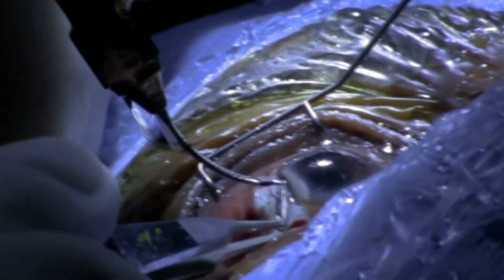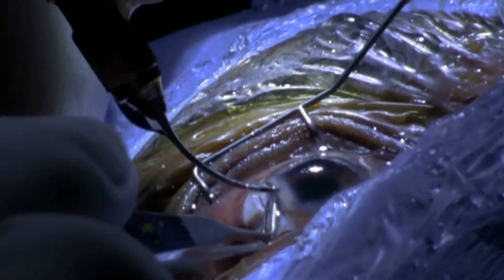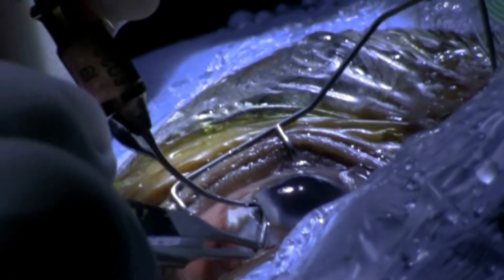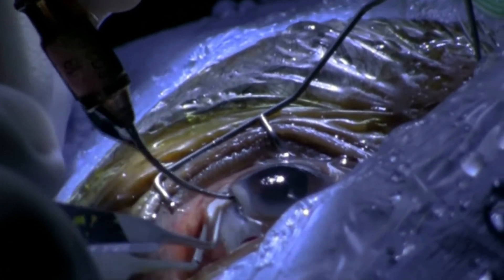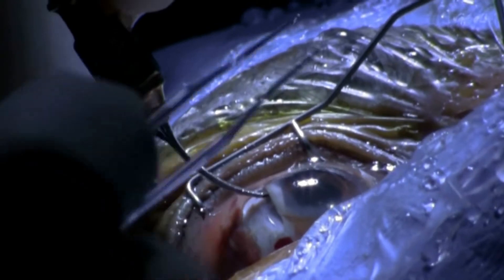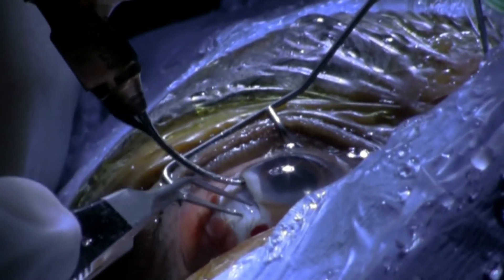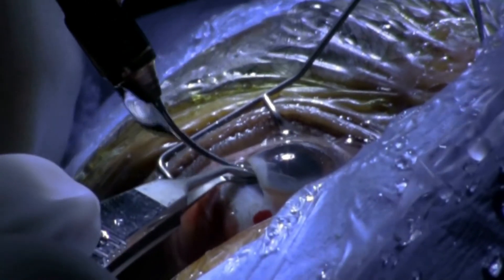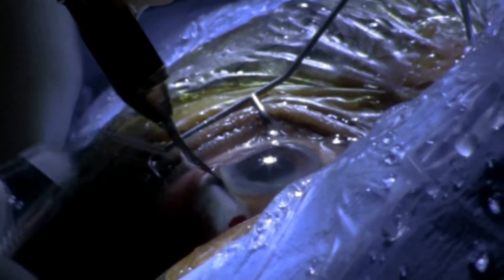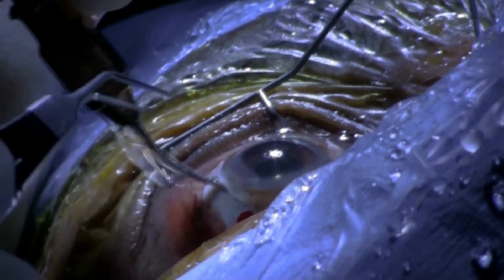The Barica speculum has wire blades for eyelid retraction without any lid guards, providing easy and wide opening of the eyelids with a fully exposed blade margin during surgery. The soft spring action protects the eyelid from excessive stretching and injury.